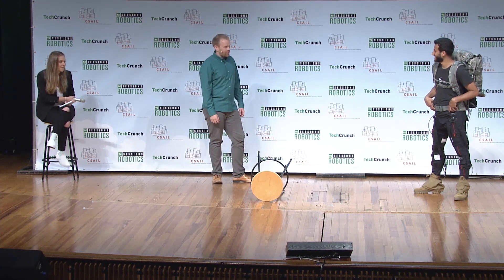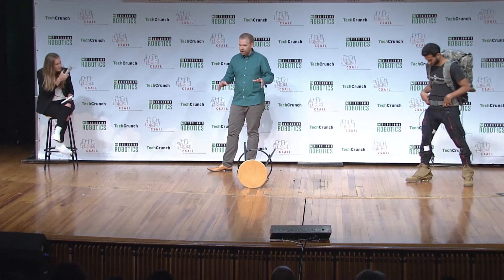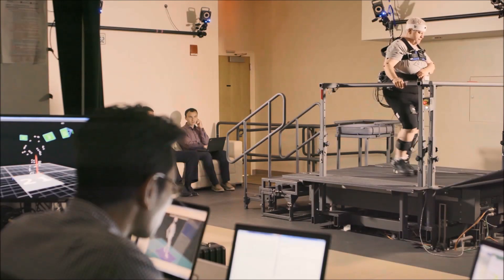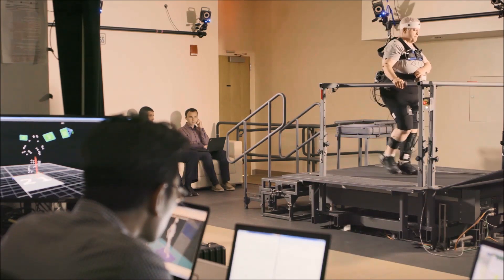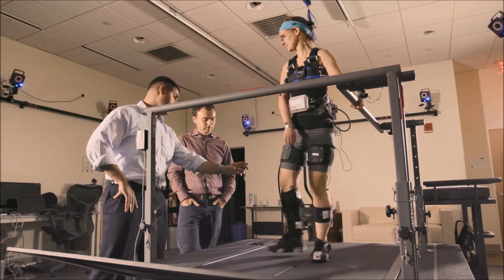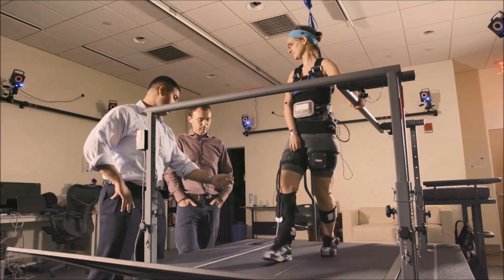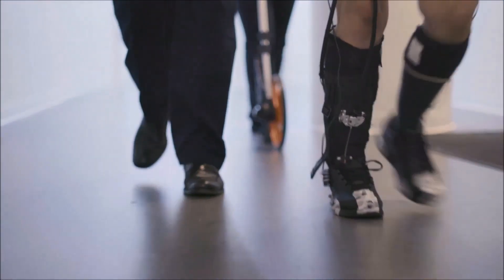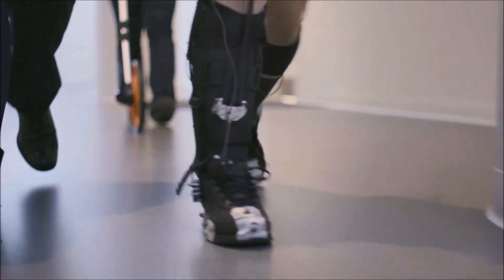We're also looking to apply this technology to people that have some kind of physical impediment. We've partnered with ReWalk Robotics — they've already built an exoskeleton for people with spinal cord injury, and they're going to help us commercialize a system that rehabilitates people who have had a stroke. In that case, they've lost mobility in one leg: they're not able to pick their toes up to clear the ground, and not able to push off effectively. Our system straps around the calf, picks up the toe to help with ground clearance, and pushes off to help propel them forwards.